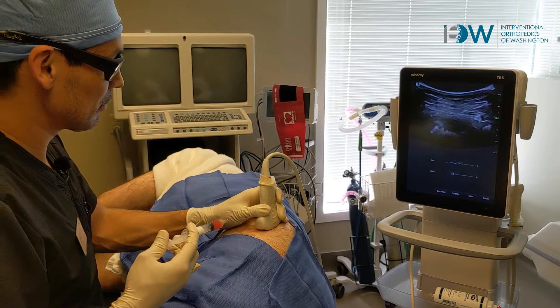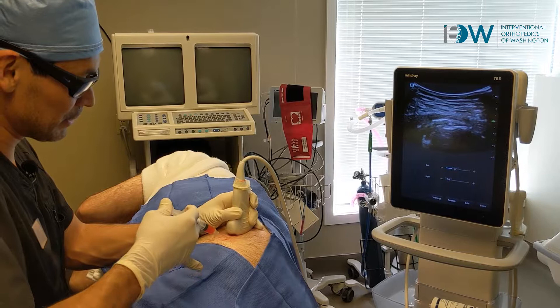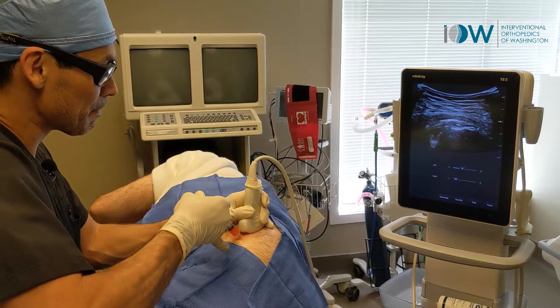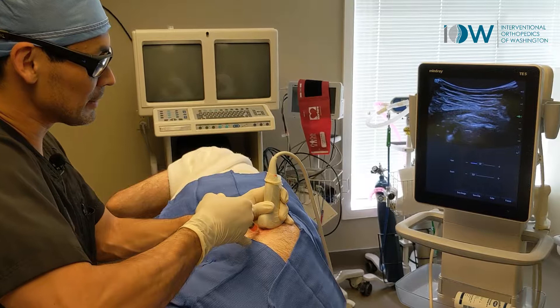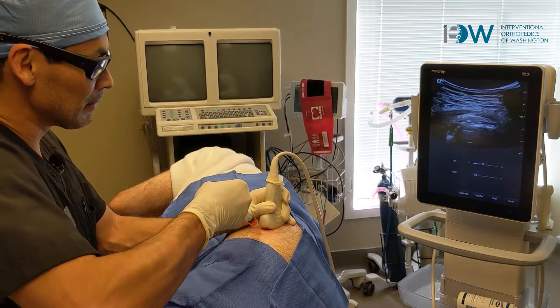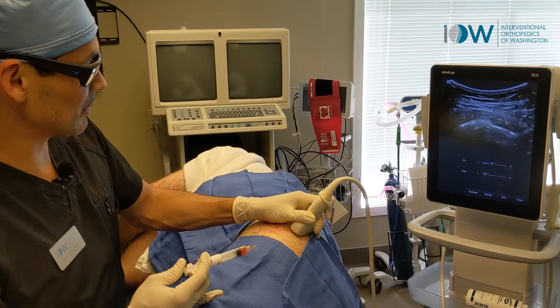Not too bad. Then we're going to take that next level up right there into glute medius. At multiple locations, some of this fenestration is the technique necessary to really stimulate that immune reactivity and healing. Right here, tapping a little bit at the attachment point. You can see it's definitely experienced some trauma. There's some significant irregularities all along that trochanteric head.